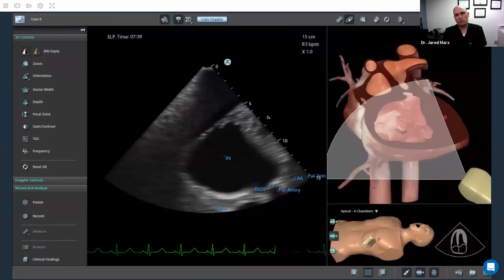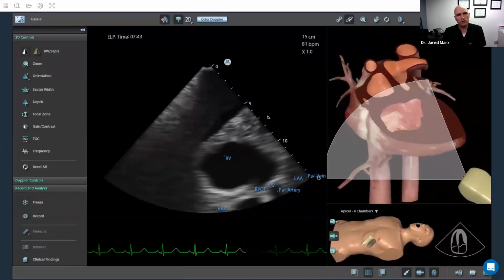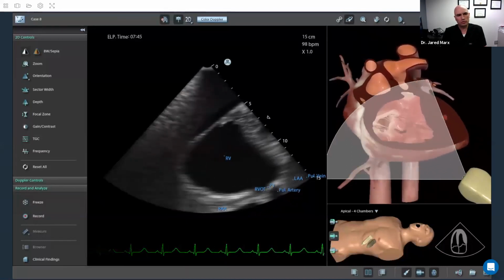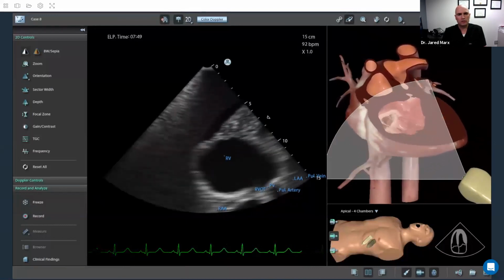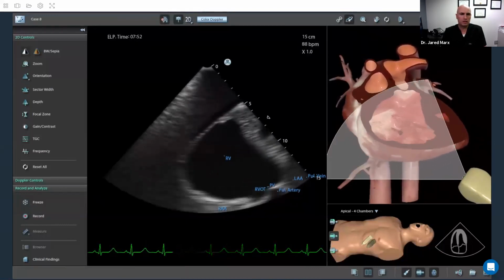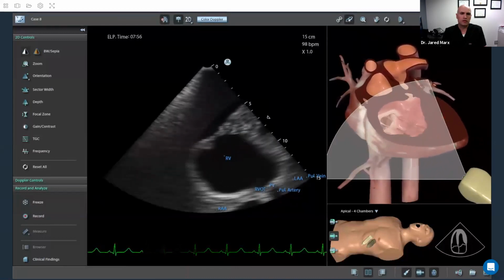But one of the most difficult ones to approach patients is especially transvaginal ultrasound. So using simulators to represent that is ideal, because it gets people comfortable with the anatomy and with recognizing some pathology.